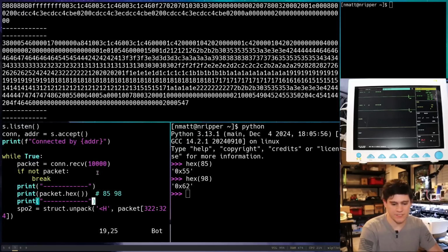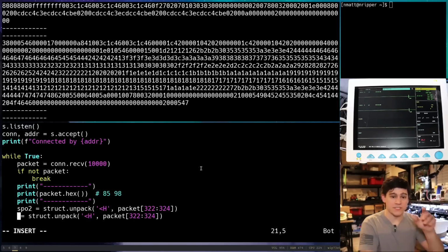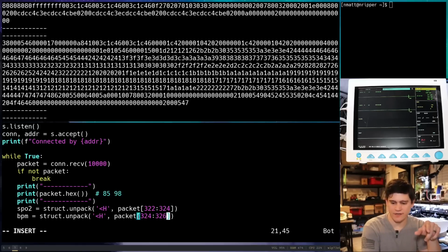And then we're additionally, at the same time, going to parse. Wait, do I have that? Yeah, that looks like a good line of code. All right, we're getting rid of this so we can see our stuff. And then, because the beats per minute is right after that, we're also going to parse that next bit there. Because again, we're talking inclusive slices, and this is exclusive.